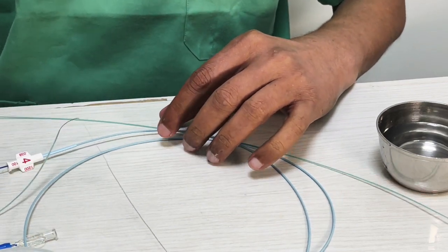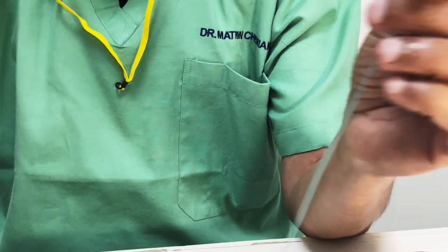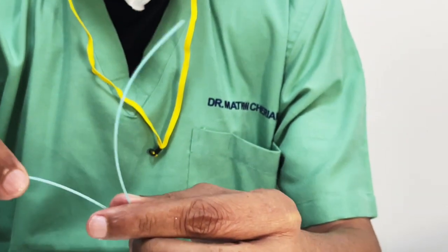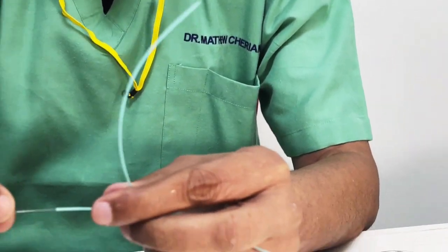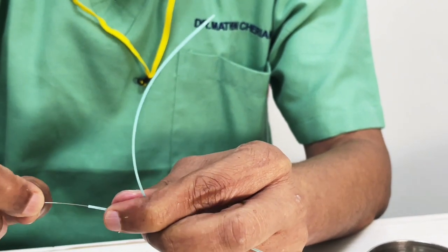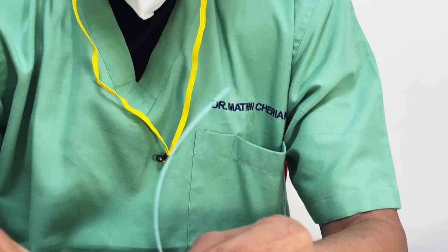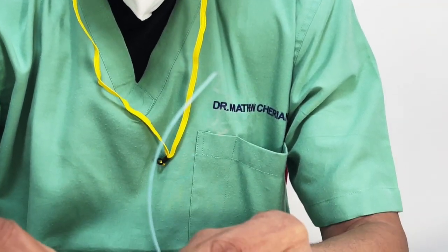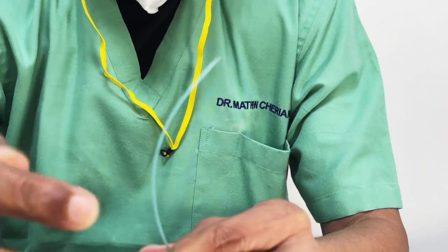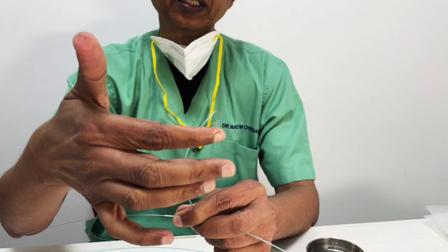So I'll show you another one. What is the coil size actually? 4-8 360. So this is called a 4 diameter, 8 centimeter length, a 360 curve. So what does a 360 curve look like? Let's have a look. See. Now this curve, can you see, is a 360 curve. Understand? It is not a helical. So actually to see the curve, you have to put some pressure. Can you see that now? Now you get the 360 curve.